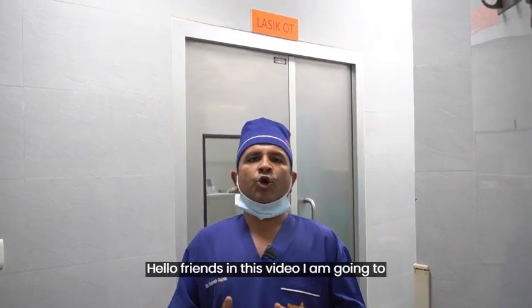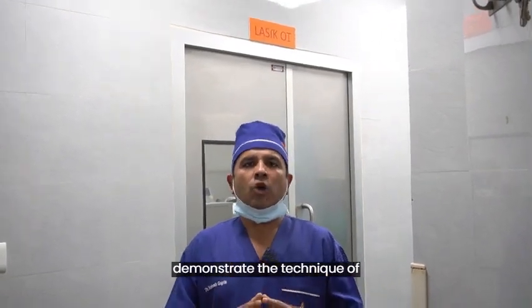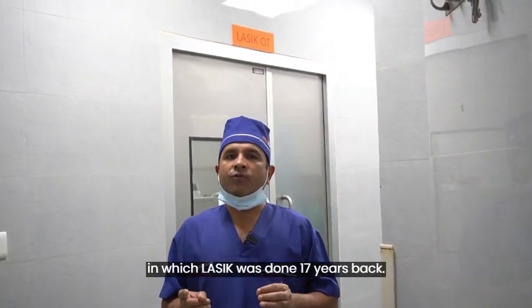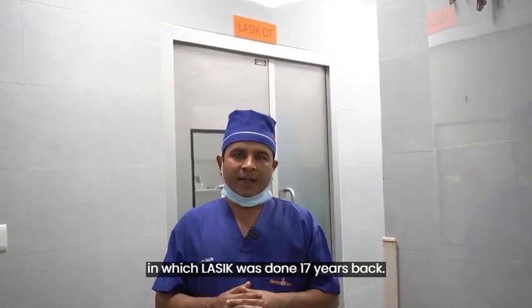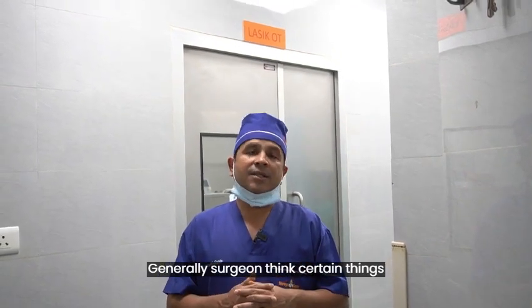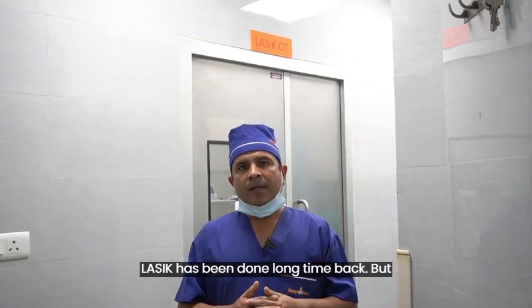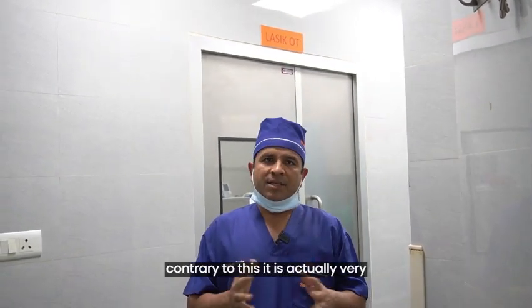Hello friends, in this video I am going to demonstrate the technique of marking flap edge and re-lifting a flap in which LASIK was done 17 years back. Generally, surgeons think that it is difficult to lift the flap if LASIK was done a long time back. But contrary to this, it is actually very simple.